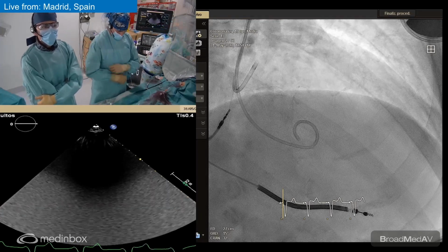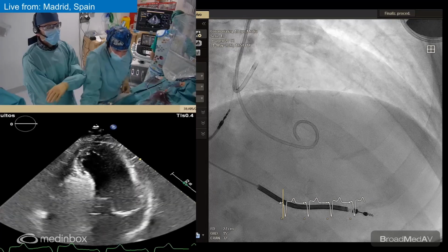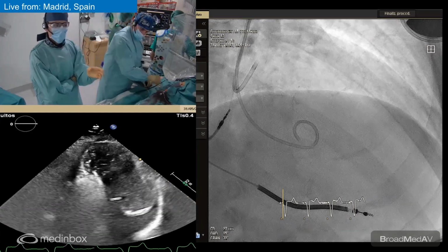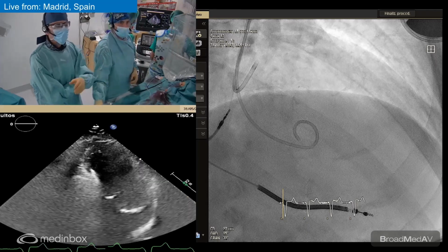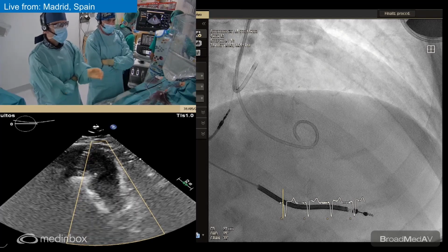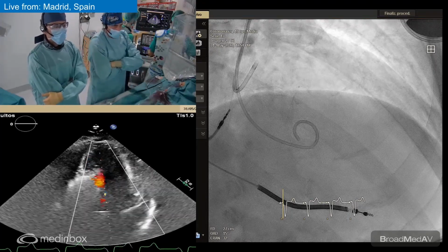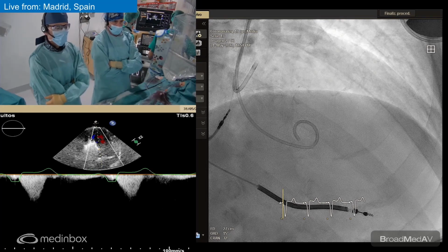So just to recap, in case the connection is cut: alcohol septal ablation in a very big septum, 27 or 26, successfully reduced the gradient by more than 50% with no immediate complication. Different septal branches, starting with the one we see in the echo being the good one with the contrast you use, and trying to avoid any complications is the most important thing in this procedure.